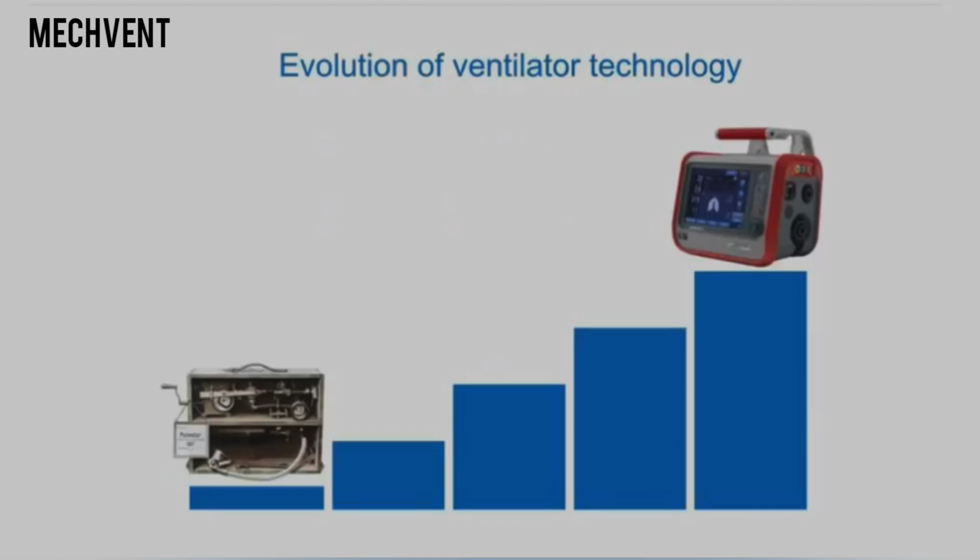At the very beginning, ventilator design was simple and rigid. Ventilators worked well only in a passive physical model. When a ventilated patient breathed actively or his or her clinical condition changed, asynchrony was inevitable. If this occurred, the operator only had 2 options, either to adjust the settings around the clock or to suppress the spontaneous breaths. Neither is a good option.